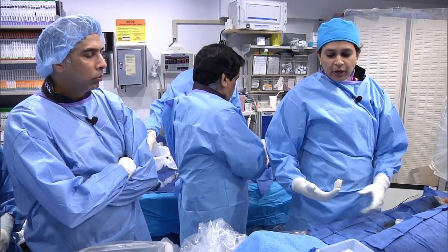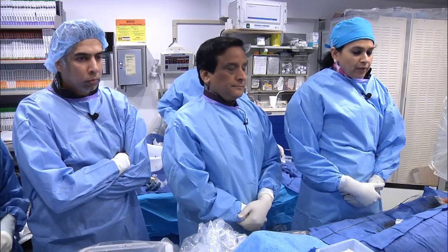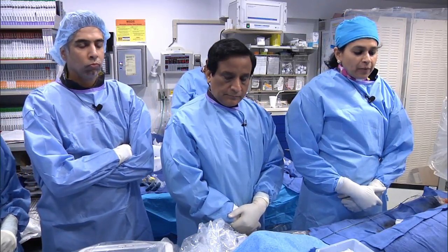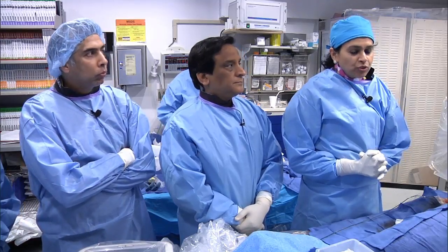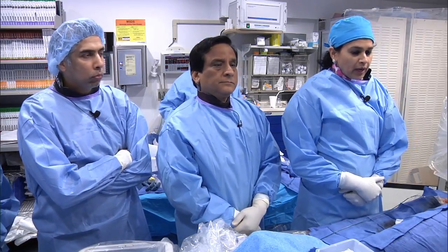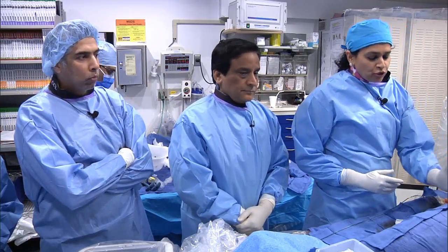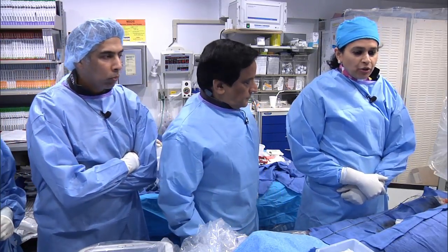And we know nowadays patients as well as referring doctors are somehow requesting radial. For me, and you've seen the amount of procedures we've been doing, the complexity, the way we are doing the procedures, I still think femoral is better for us. For people who are doing complex procedures, radiation exposure is very high. Already we have very high radiation exposure because the number of procedures we do is very high, and the complexity of the cases. We are closer to the radiation when doing the radial procedure compared to femoral. You may still be away with femoral, and that will definitely matter as the number of years you are doing procedures adds up.